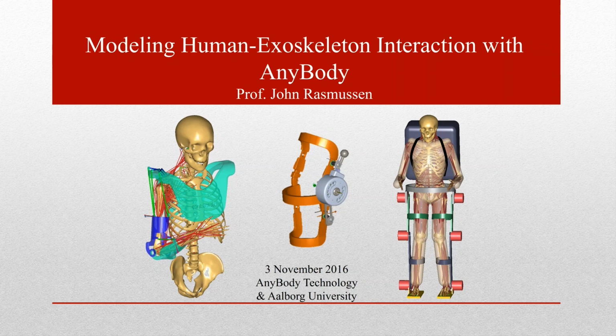Hello everyone. Welcome to this webinar which is on modeling human exoskeleton interaction with AnyBody. This is a joint event between Aalborg University and AnyBody Technology. We appreciate your time and hope that by the end of this webinar we have successfully introduced and discussed a few concepts and techniques for what's called in silico modeling and simulation of exoskeletons using AnyBody modeling system.